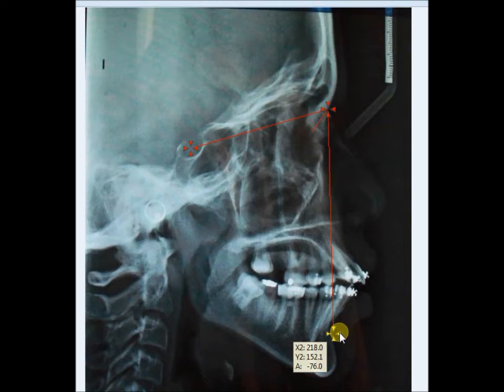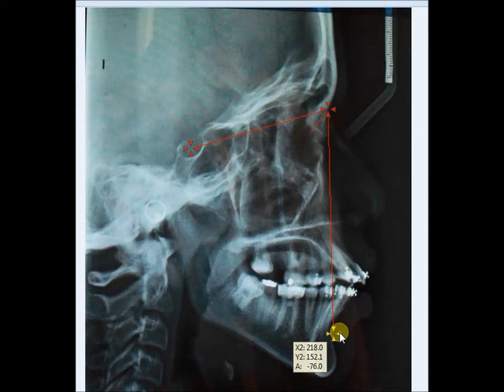To save this to your computer, click the Print Screen button on your laptop or desktop — that will save the image. You can then take a printout or save it in a folder, naming it SNA or SNB, whichever angle you are trying to show, and analyze them.